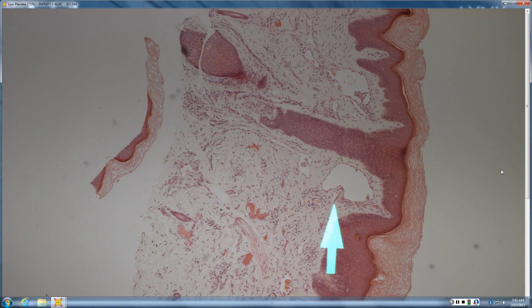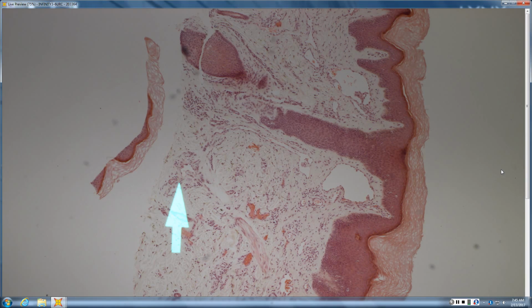What looks like lymphangioma or angiokeratoma up top, but looks kind of like Kaposi's down deep with hemosiderin and tufting of new vessel formation around pre-existing structures. Targetoid hemosiderotic. Well done, Robbie! Very well done. That's exactly right.